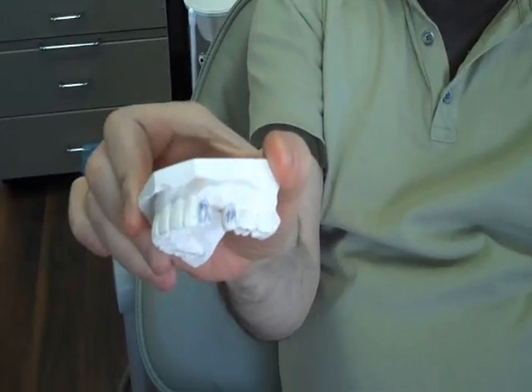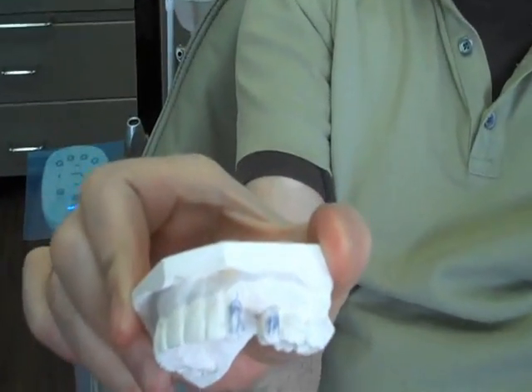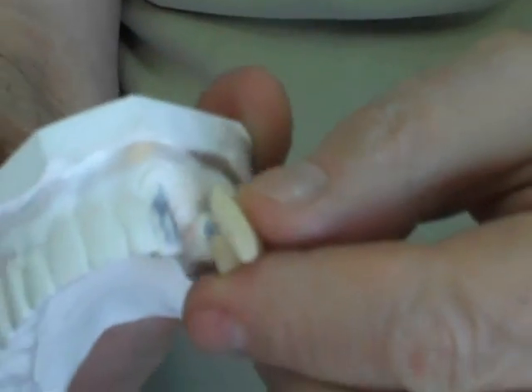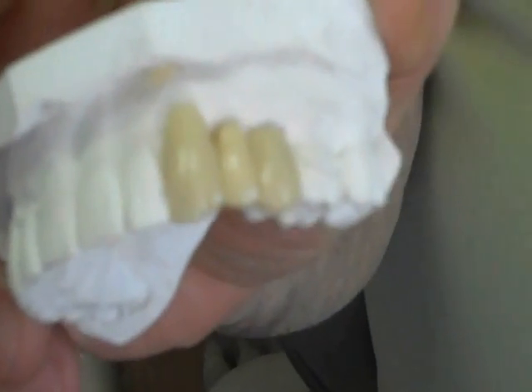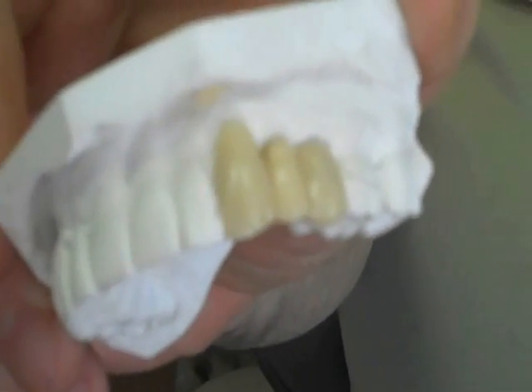Today also, later on, after the tooth is taken out, the tooth has been taken out on the model. And prior to today's surgical work, I had a temporary bridge made. So later on today, I'm going to have this bridge placed in the empty space where the tooth has been extracted. I've already taken this morning and yesterday and the day before an antibiotic as a safety precaution.